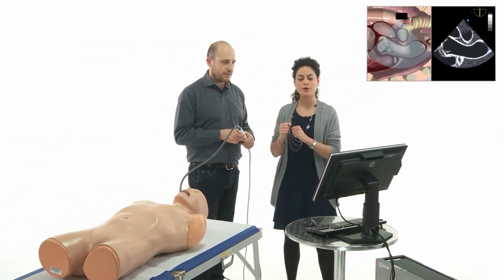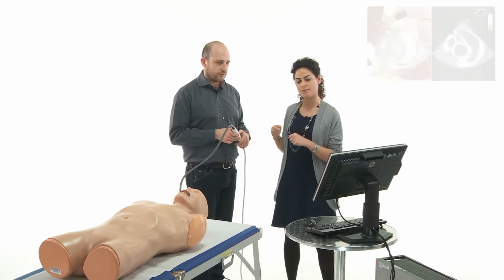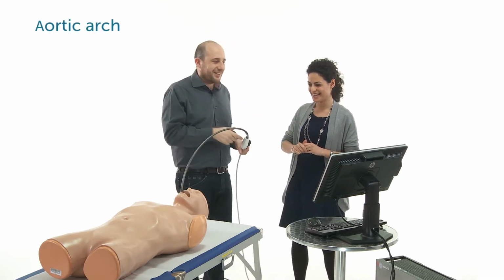Just to sum up, what you need to scan the aorta during a transesophageal exam is you retrieve the probe, and then you can get the short axis and the long axis just by playing with the angle, 0 degrees, 90 degrees. But wait, Bruno, we forgot to show the aortic arch. Oh my God!